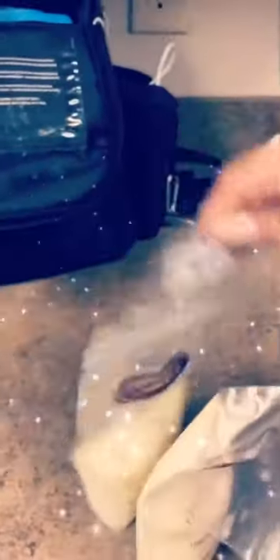Then I label my bags. So: bags, bottle — there you go. Easy.